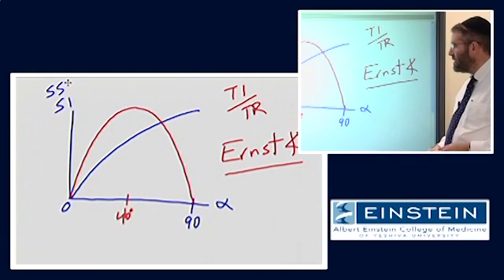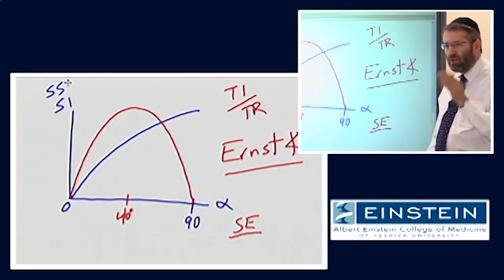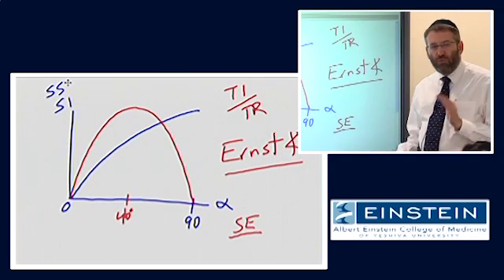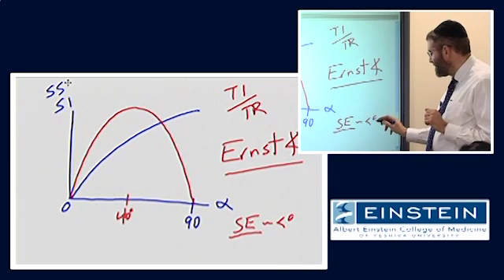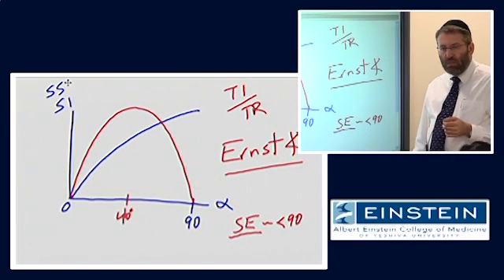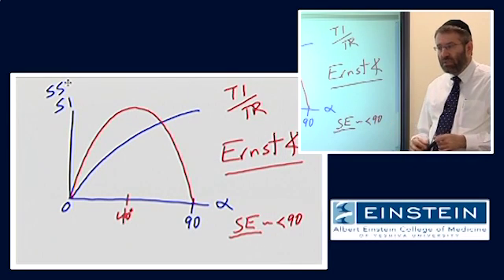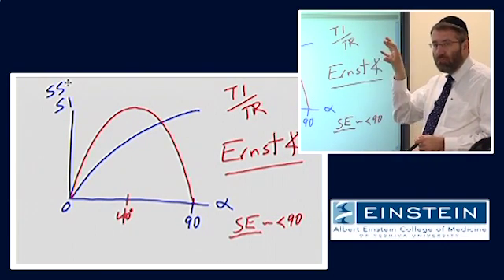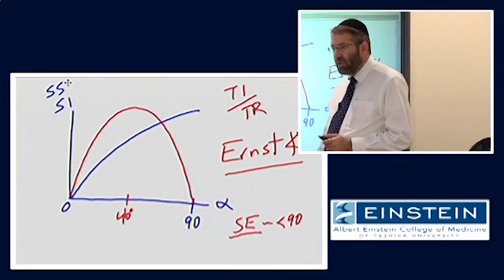Right? So some people might be surprised to know that even when we do spin echo imaging, where we think of that always being a 90 degree flip, the TRs are generally not that long, not long enough to allow full recovery of the longitudinal magnetization. And as a result, typically these are going to be accomplished with flip angles that are less than 90 degrees. Maybe 70. It'll all depend on the situation and the TR. And the scanners are often optimized to choose the flip angle based on the other parameters, specifically TR, that you select. So this is how choosing the flip angle and specifically identifying the Ernst angle can allow you to maximize signal in the image. There's another way that we can use this flip angle, however.